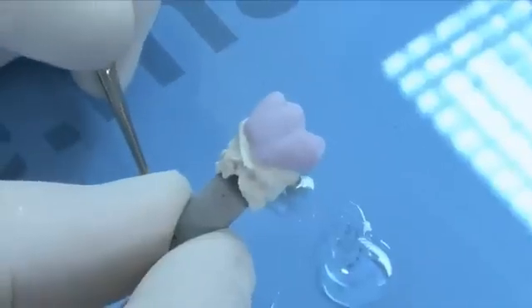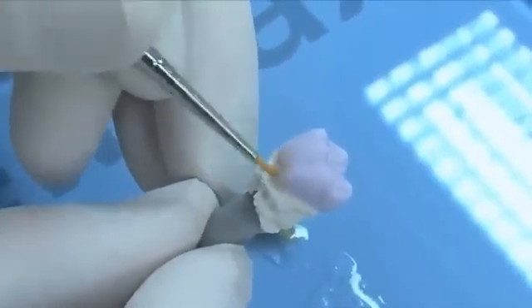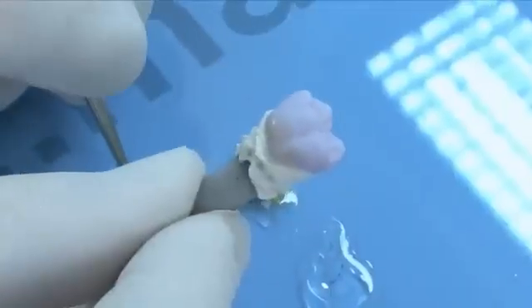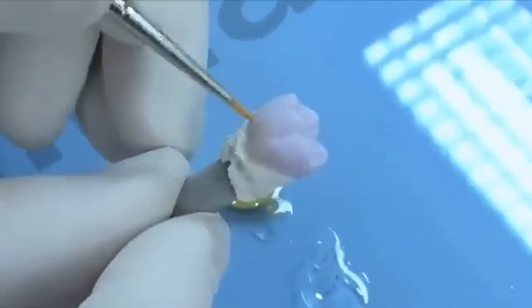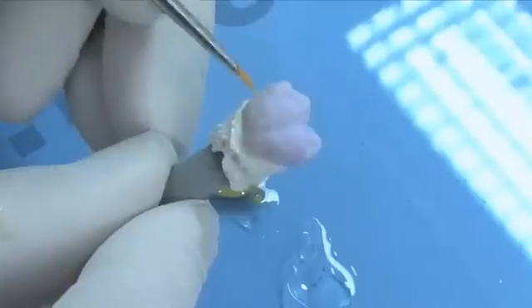For enhanced chroma in the cervical region, lightly wet the brush and begin applying a small amount of shade to the restoration. The shade paste application should be very subtle as the firing process will result in a more intense appearance.